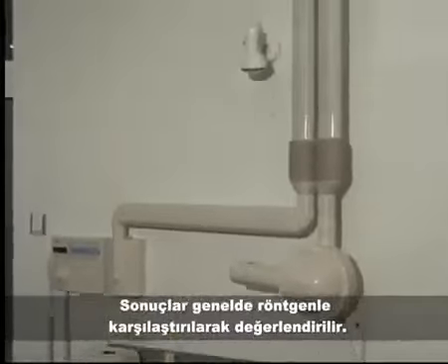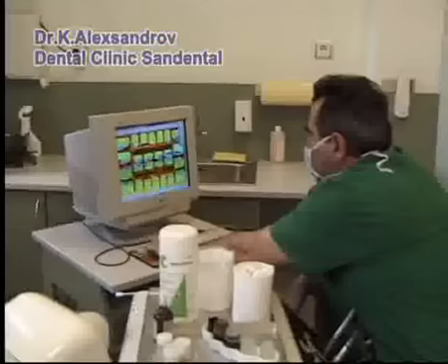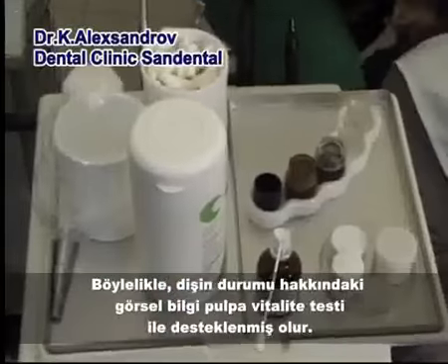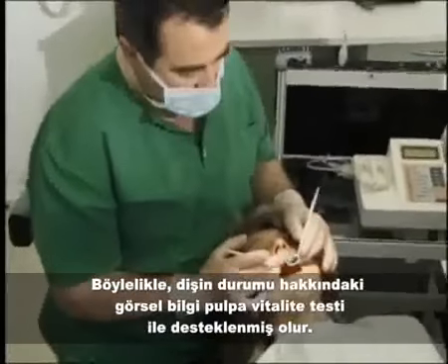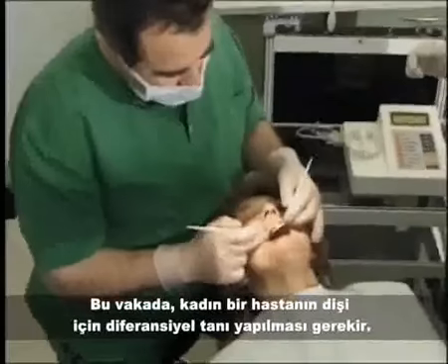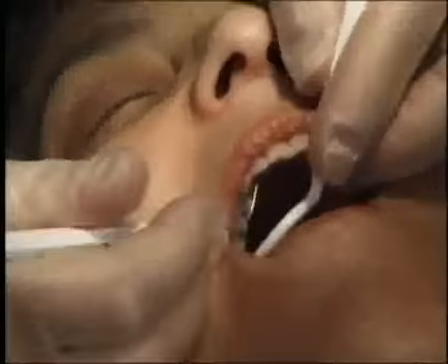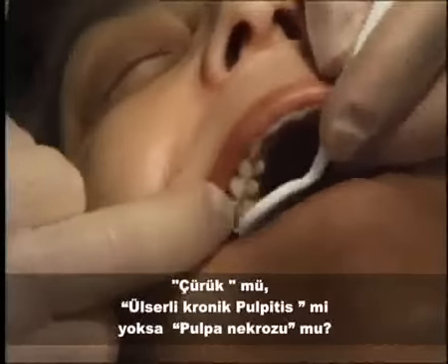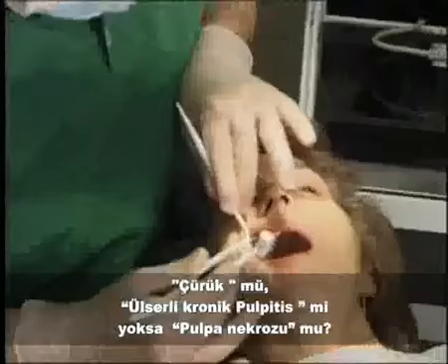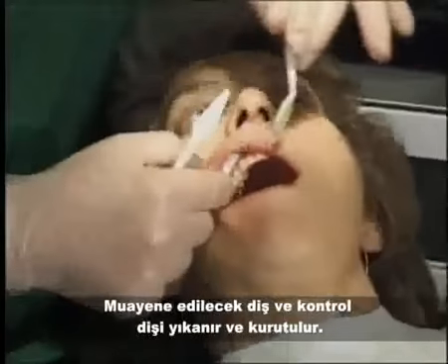Most frequently, the Electroodontodiagnostic results are compared with X-ray examination. In this way, the visual information about the tooth status is complemented by the pulp vitality examination. In our case, with a woman patient, it is necessary to make differential diagnostics between caries profunda and pulpitis chronica ulcerosa or necrosis pulpae. The measured and controlled teeth are cleaned and dried.